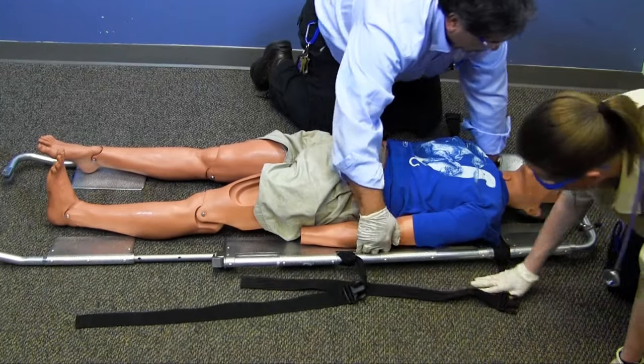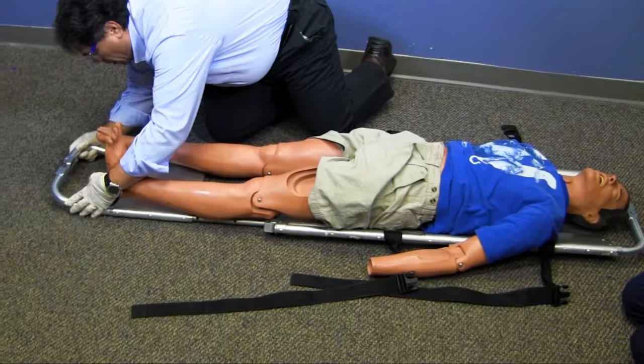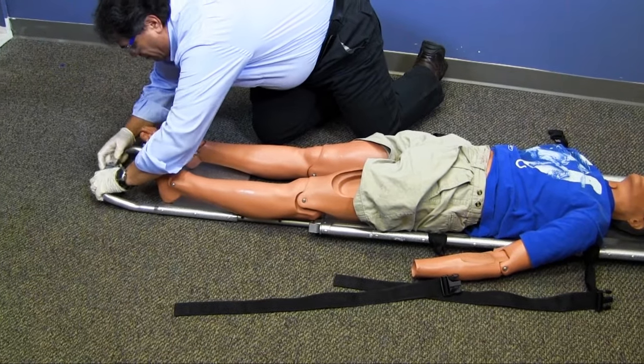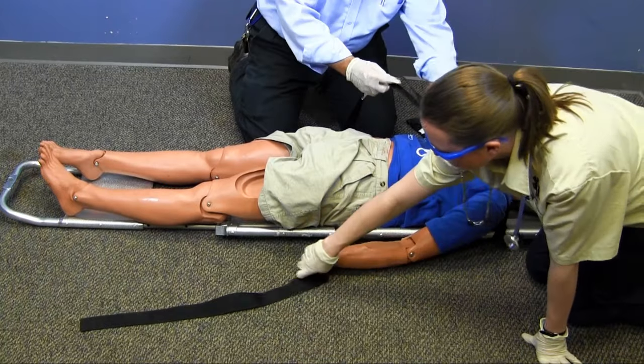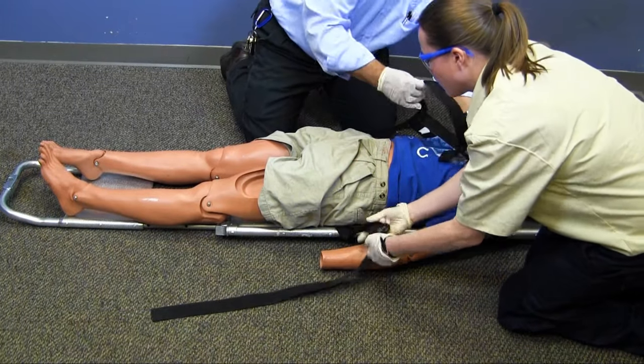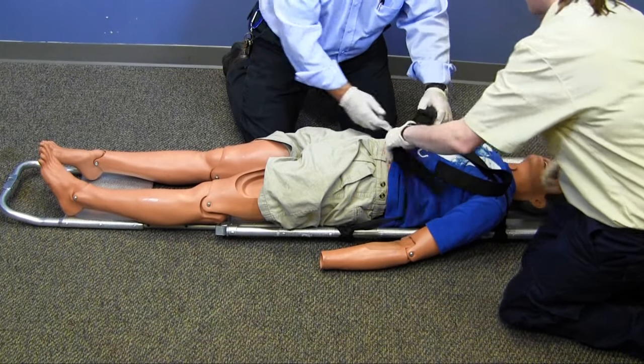I will now position the second side and secure the latches at the head and the feet. To make sure the patient does not shift on the stretcher, I will use a strap to secure the patient to the scoop. I will also place padding behind the head to maintain a neutral position and provide for patient comfort.